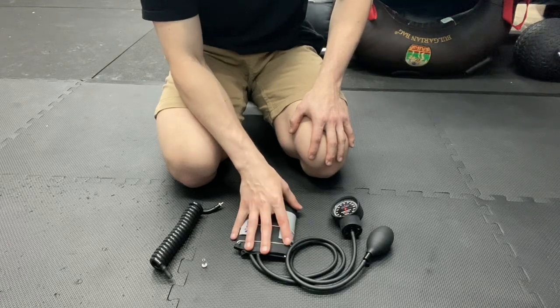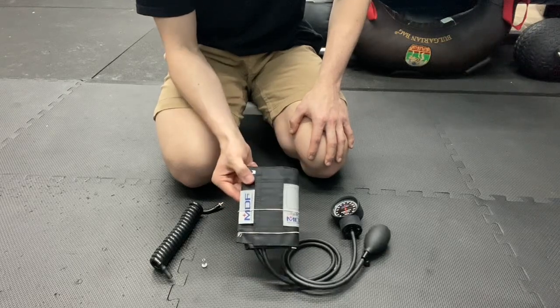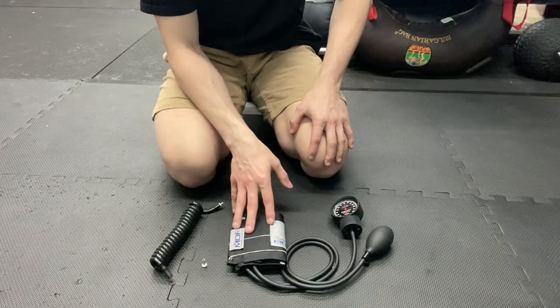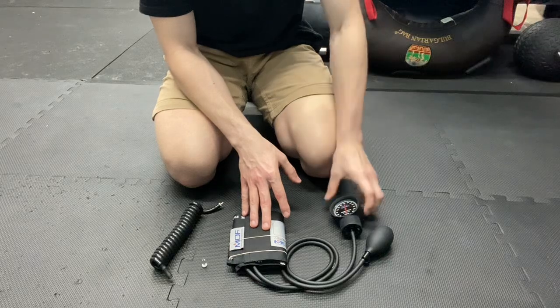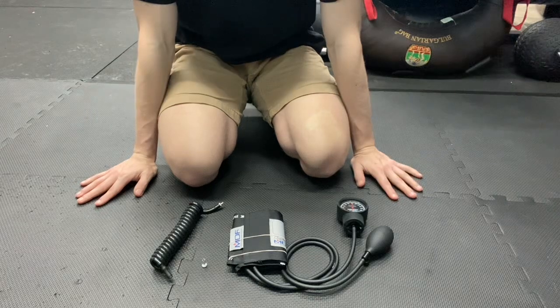You can get these on Amazon. There's a lot of different options out there to get. I like to use the MDF brand. There's also the ADC brand, which is also very good. This one I believe is made in Germany or Austria, somewhere in Europe. So they calibrate theirs very well. Everything's really well made and solid. It's not too expensive of an option.